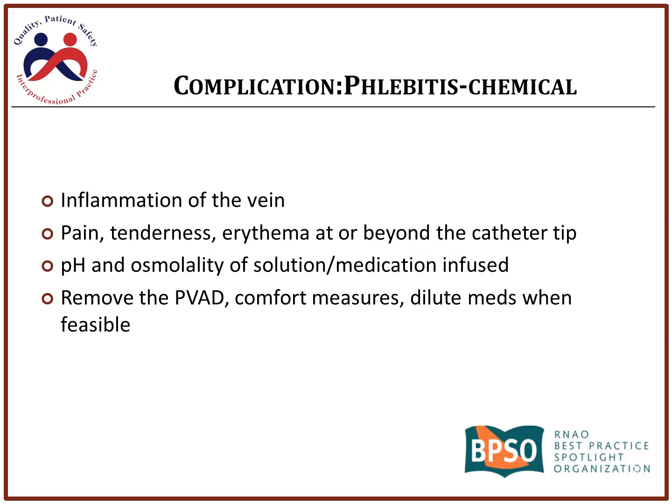The other thing is your selection of the size. Our cannulas typically come in a 20 or a 22 gauge. The higher the number, the smaller the needle. 18s or 16s are often used in Emerge. Those are for larger vessels, and typically they're delivering a lot more fluid, maybe in the case of resuscitation or something.